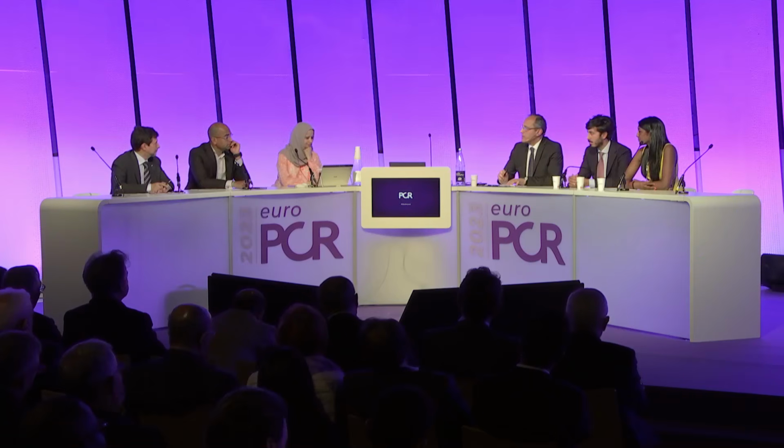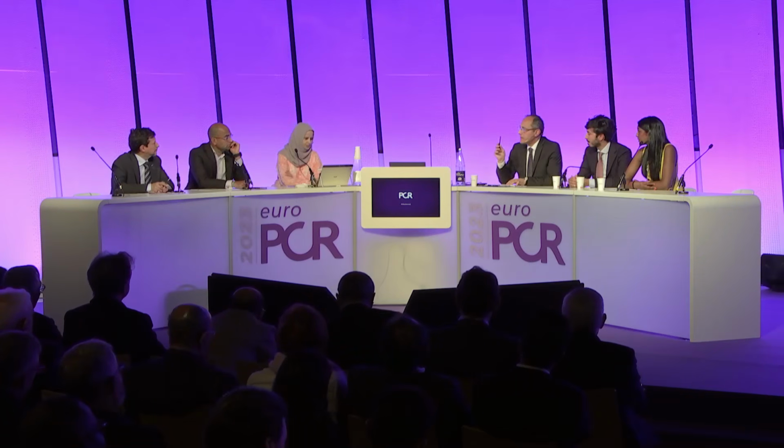Now I'd like Ajay to help us in applying the 1, 2, 3 algorithm at this stage of the procedure. So did we do a good job so far? What is the analysis of the IVUS you have seen after rotational atherectomy? Yeah, I think the fractures were great. I might have done the IVUS run, as you mentioned, after the 1.5, or tried an NC balloon after the 1.5 to see if that was sufficient cracking.